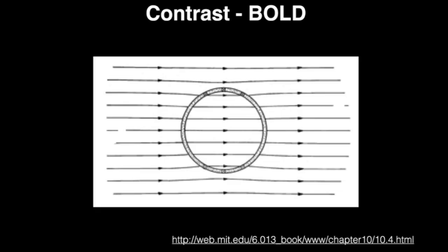That makes the inside of the blood vessels less paramagnetic, i.e. more diamagnetic, i.e. more like the outside tissues, so more uniform. So in a situation like this, where the fields between the inside and outside are more uniform, you will have less dephasing in your T2 decay, so you'll have a stronger signal.